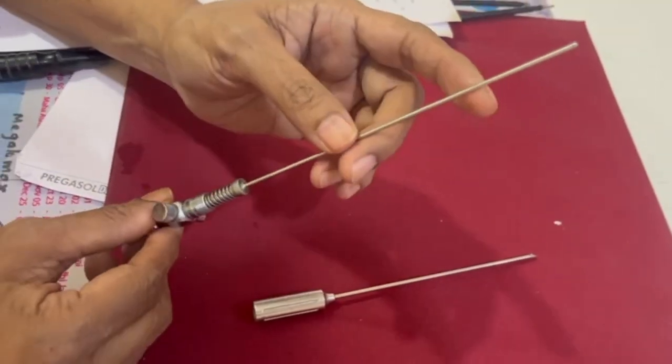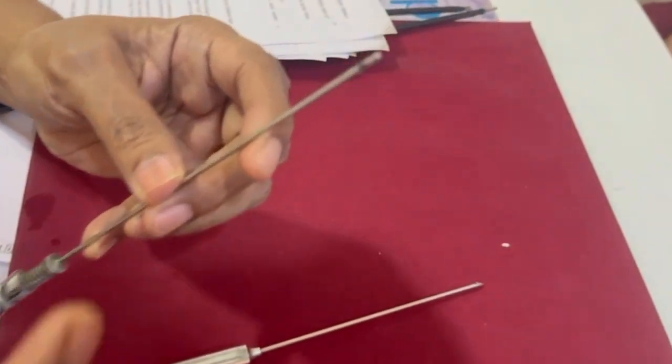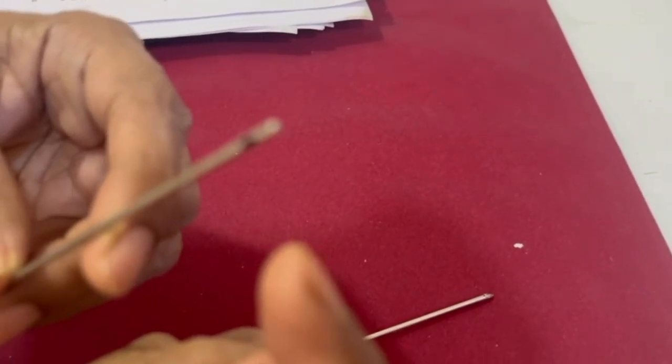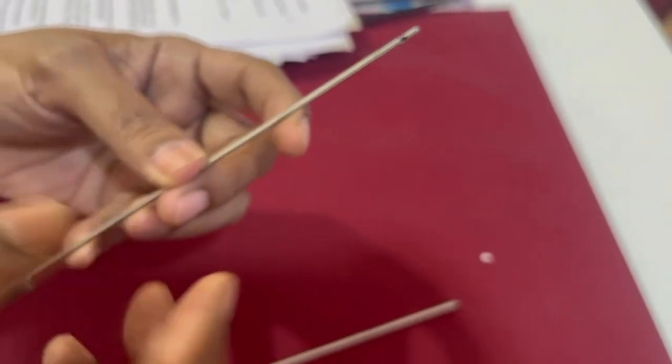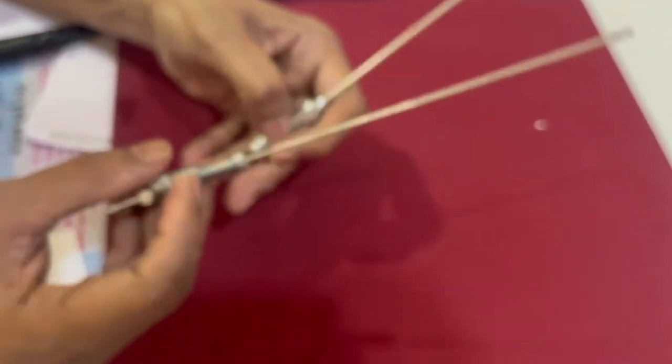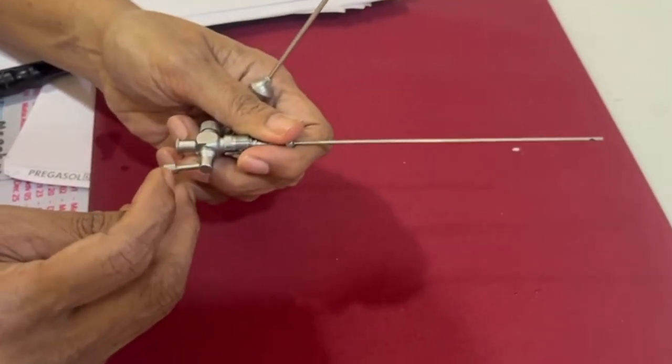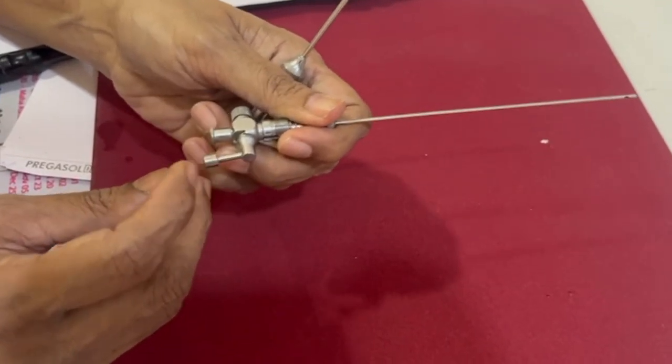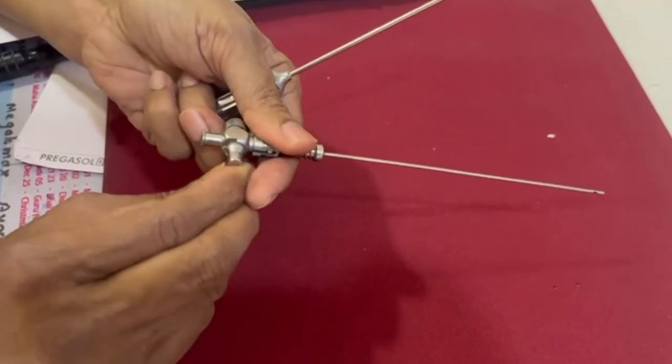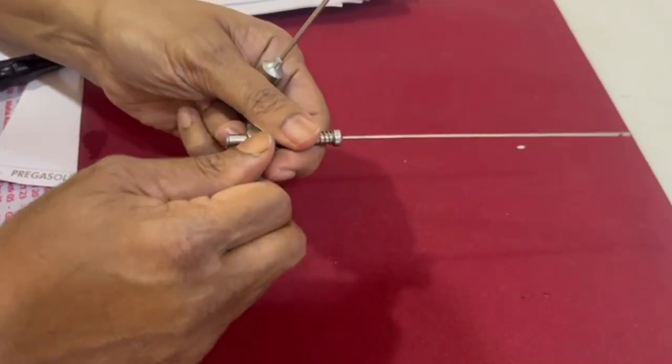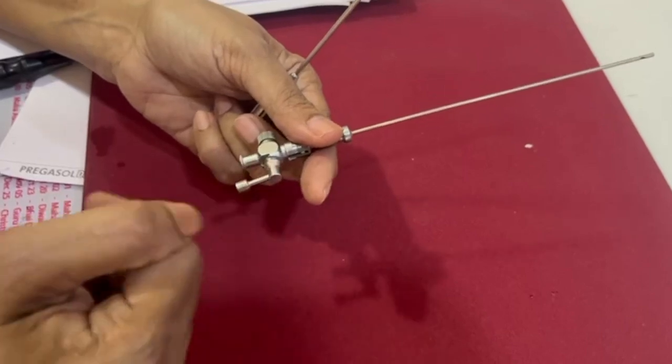The inner one has a spring here. This is called the obturator with a sub-terminal opening. You can see the opening here through which the pneumoperitoneum can be created. When you put this in this direction it is open. When you turn it around this way it is closed. This is the open one which is perpendicular.